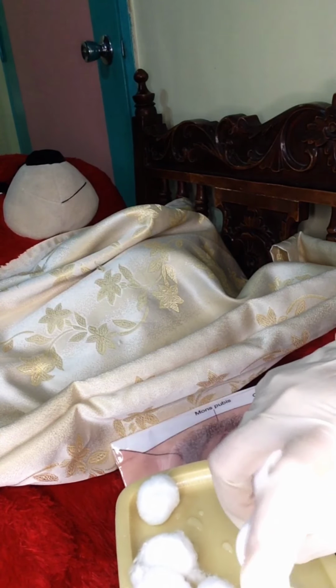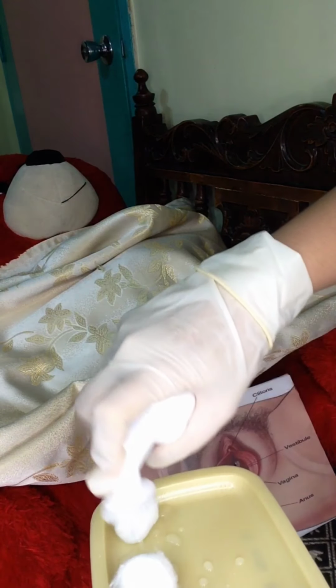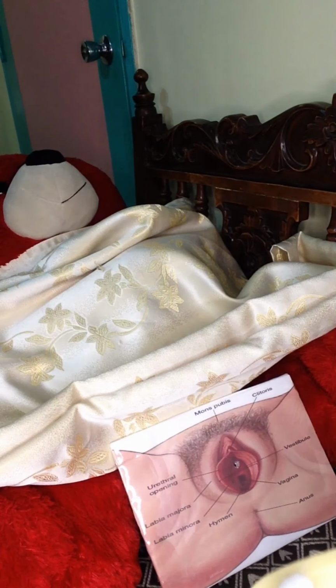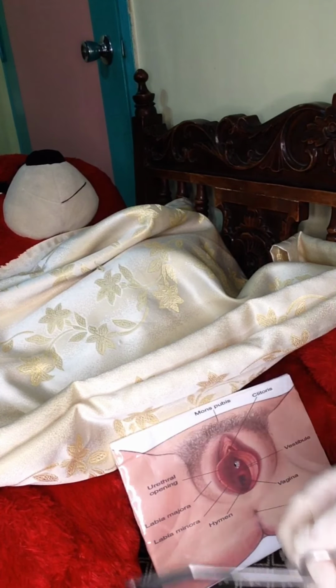We will soak our cotton ball. We will cleanse the genital part of our patient, and this one is like the perineal flushing.